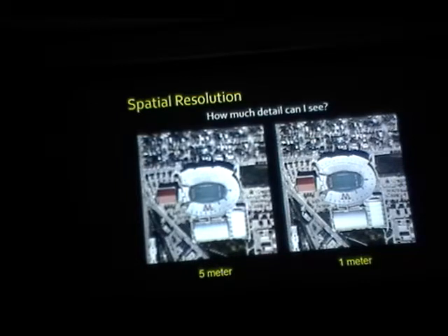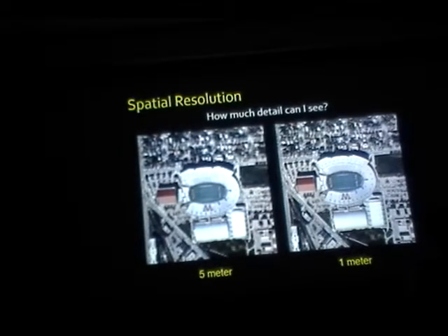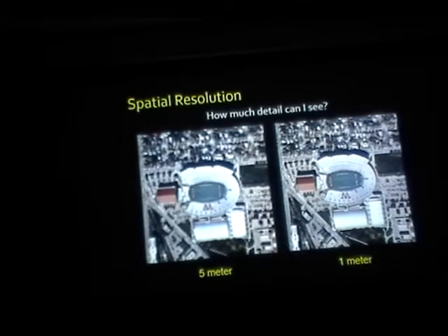Now, translating that into dentistry. If you want to see a minor fracture, like a hairline fracture, versus like this thick fracture, which one do you want? You want more spatial resolution or less spatial resolution? More, right? So you need to have more spatial resolution. So spatial resolution, basically, helps us to identify very minute details.